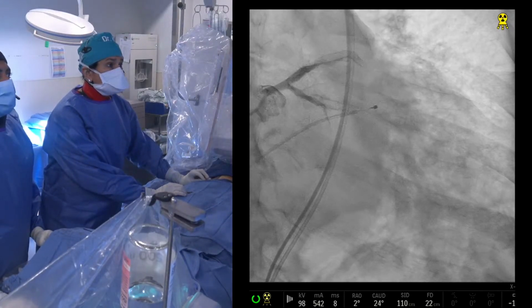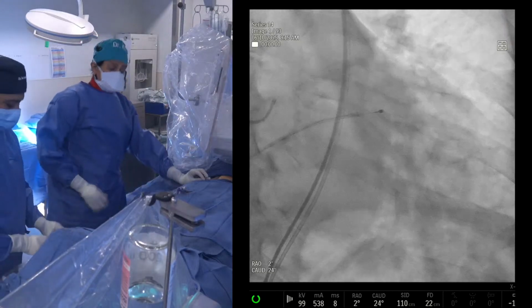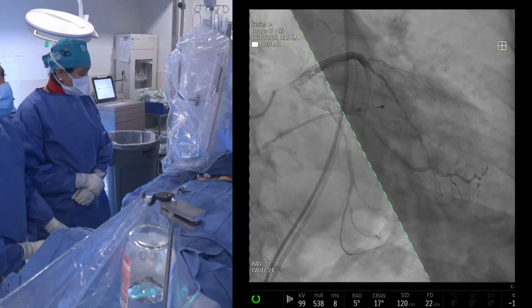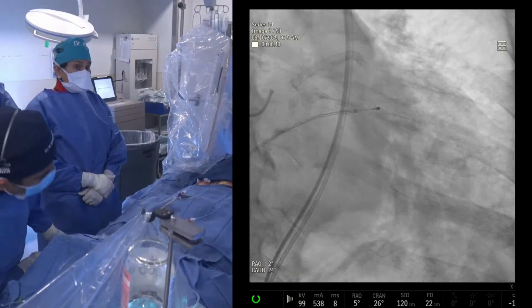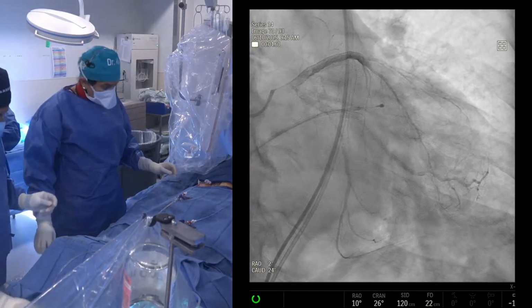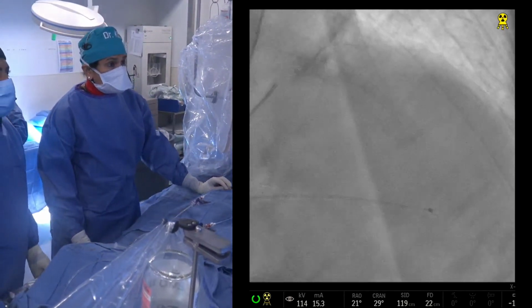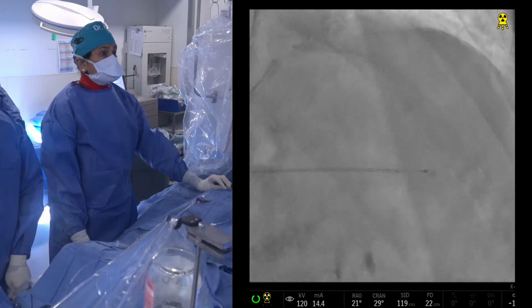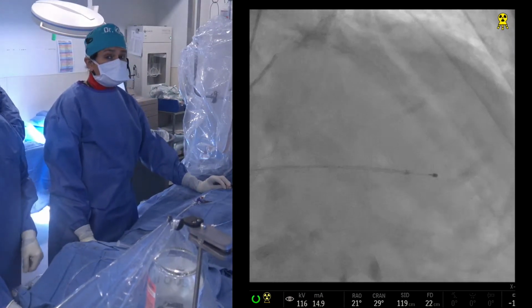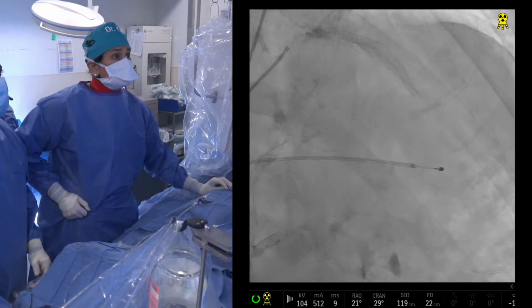And you can see that here we're now doing the coronary angiogram to confirm the previous PCI in the angiographic assessment. Dr. Kini, you want to comment on the left shot? Any concern from your end? Angiograph, recent PCI, everything looks okay. RCA will just show you. But going back to the valve choice, yeah, if you had asked me, I would have gone for an S3 26. Go.